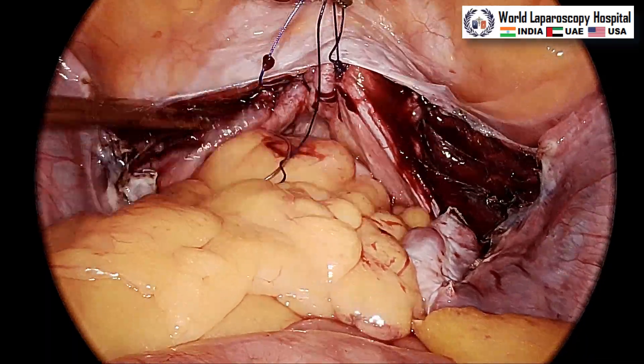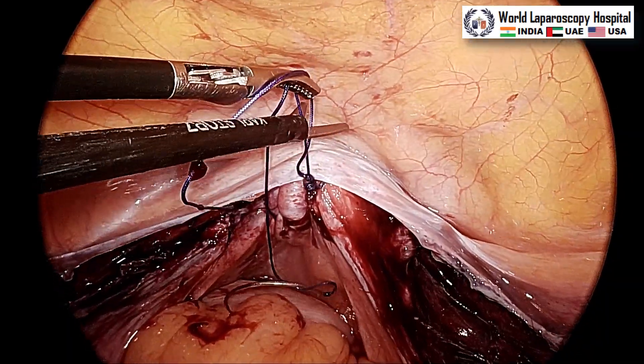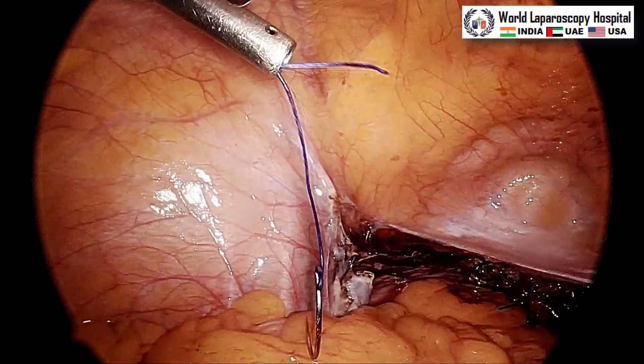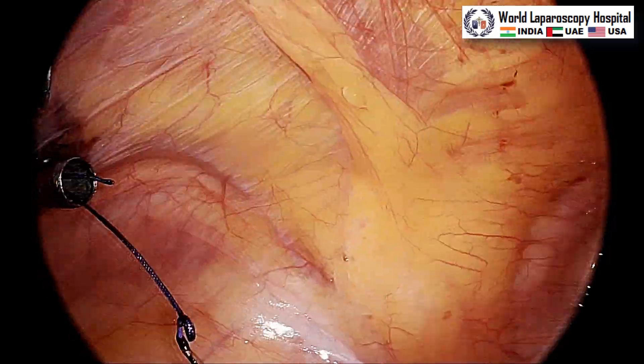You can perform this surgery with all three 5 mm ports — Stryker has very good vision even with a 5 mm telescope. After that, catch both sutures and pull the vagina anteriorly, then do suction and irrigation to check for any bleeding. Any blood collected in the cul-de-sac can be suctioned out — blood loss is hardly 5 ml. Cut the suture and take the needle out through the 5 mm port. Thank you very much for watching this video, have a nice day.